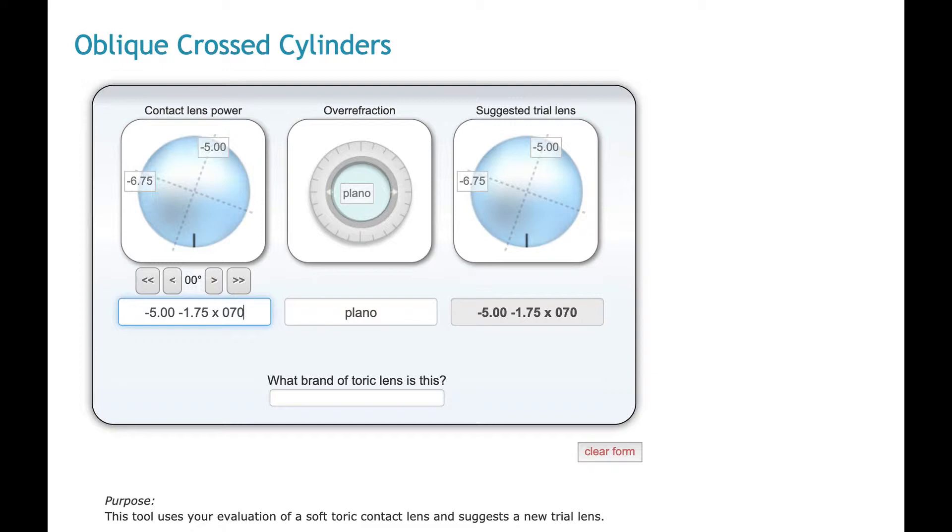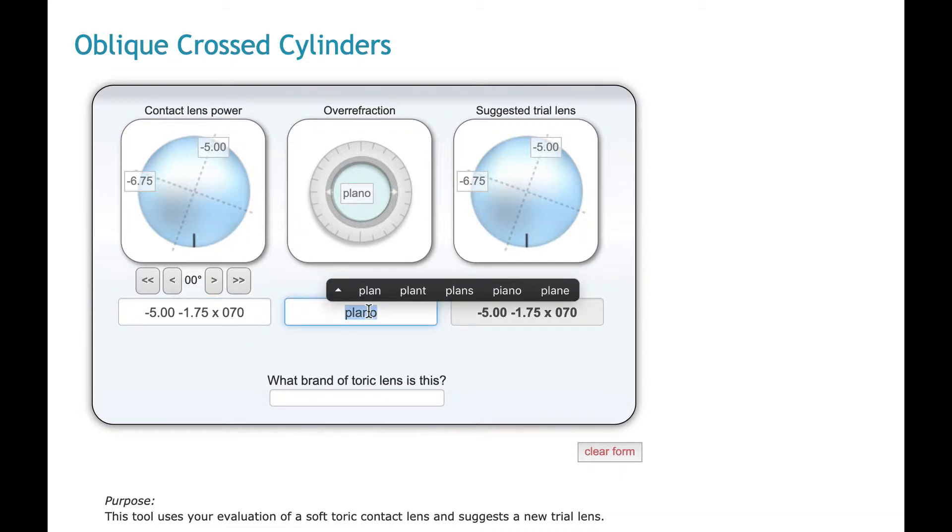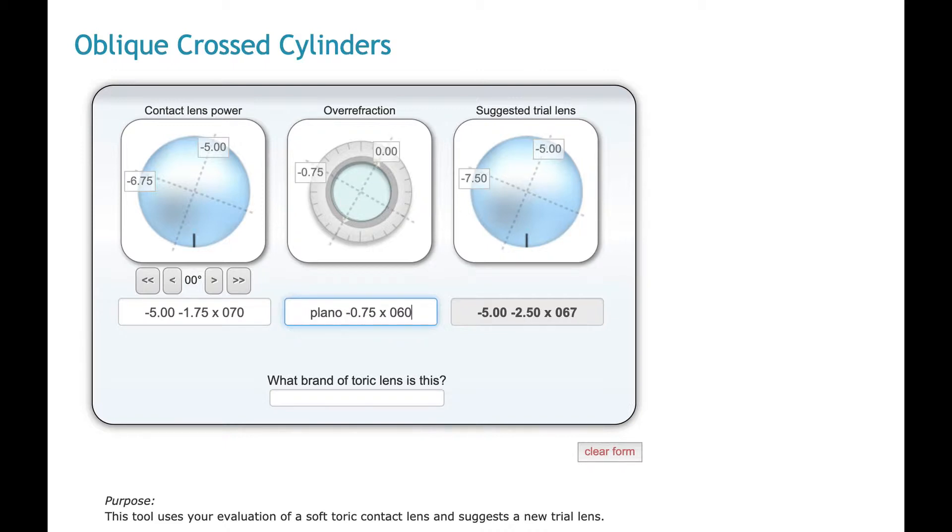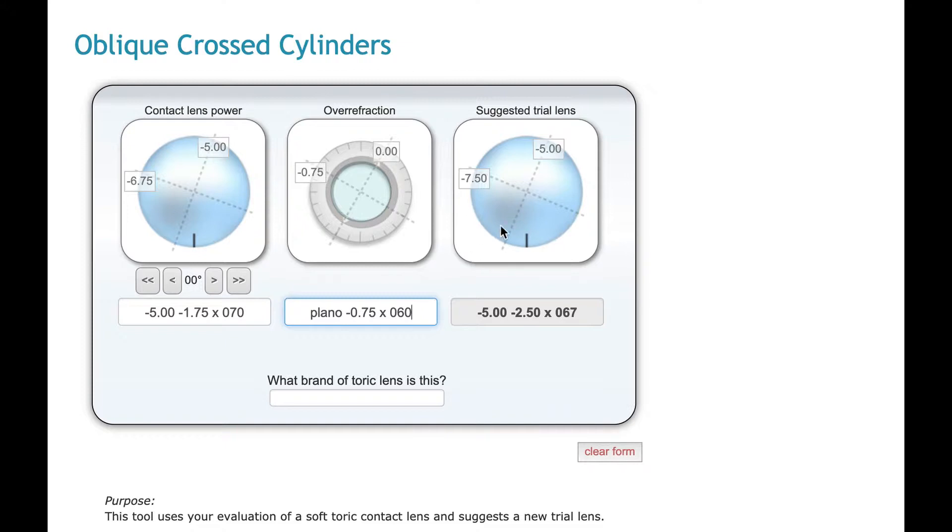The same thing is true for this middle column, the over refraction. So let's just say our patient has, why don't we say plano minus 75 axis... minus 0.75. It'll just show that on the optical cross too. And then the third lens is the suggested trial lens. We'll do an oblique cross cylinders calculation, show you the results, and show the results on an optical cross.